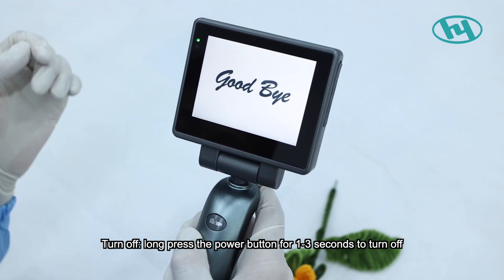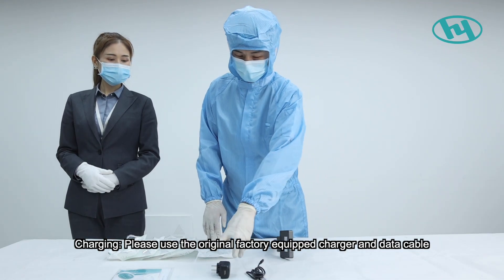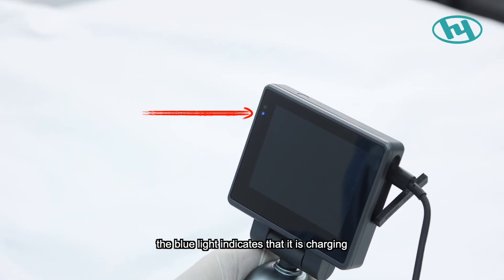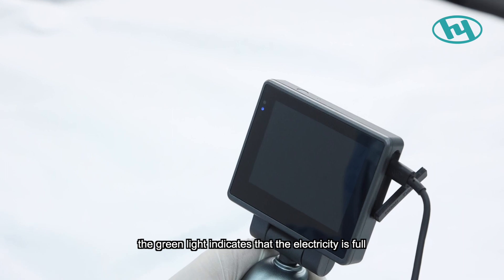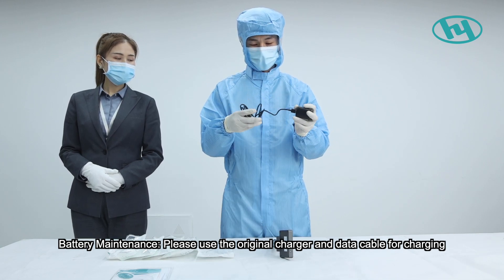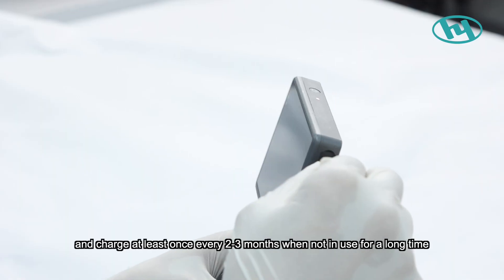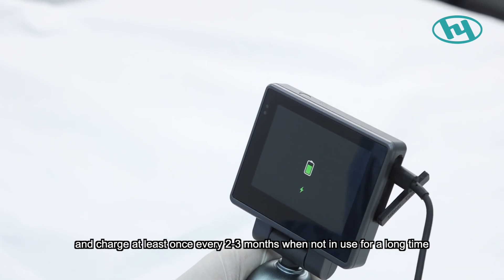To turn off, long-press the power button for one to three seconds. For charging, use the original factory-equipped charger and data cable. The blue light indicates charging; the green light indicates fully charged. Do not charge for more than six hours at a time, and charge at least once every two to three months when not in use for a long period.